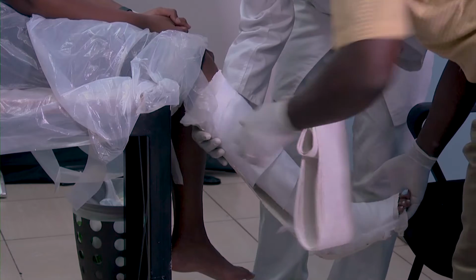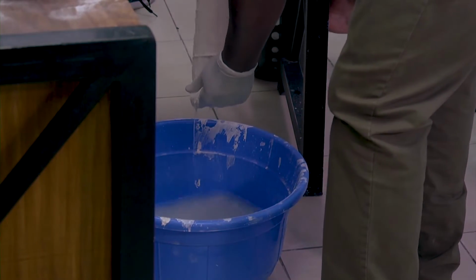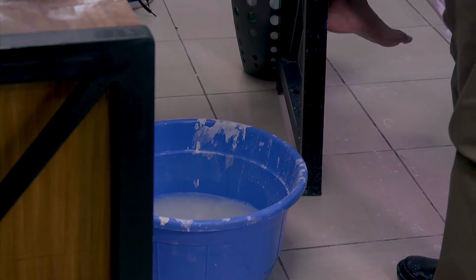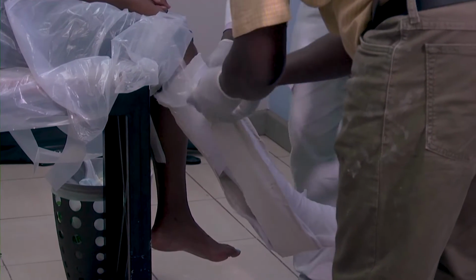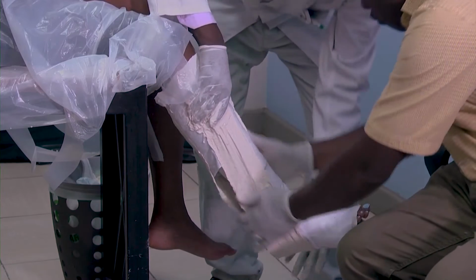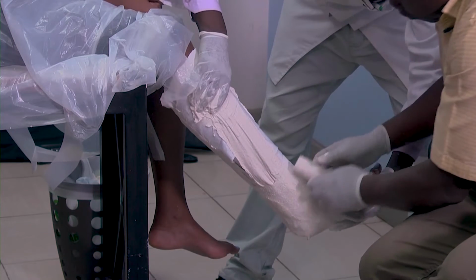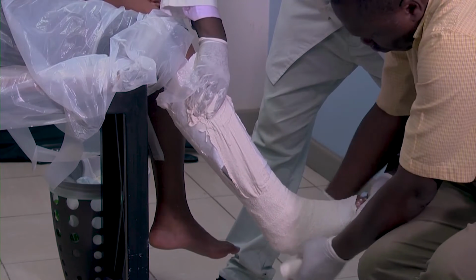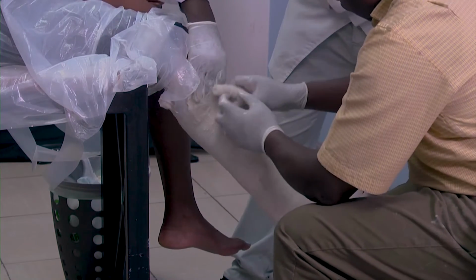You can hold this. Yes. So you bring it. Then you secure it with a crepe bandage. Use a 6-inch bandage, just the way you use it for the plaster of Paris slab, especially when you're doing the lower limb. Particularly for the below knee posterior slab, 6-inch is very important.